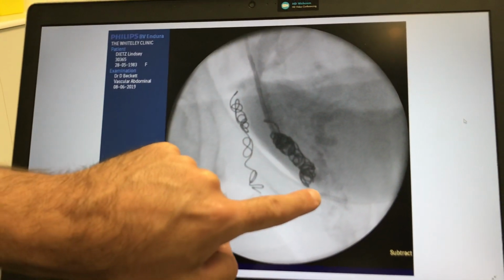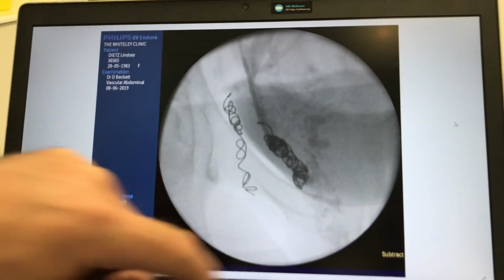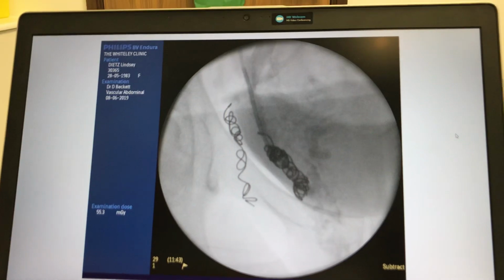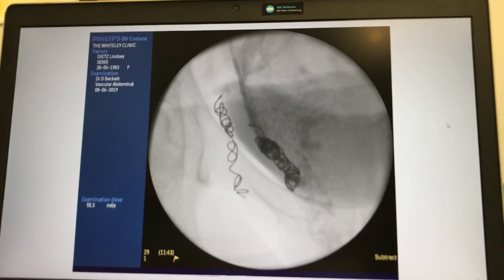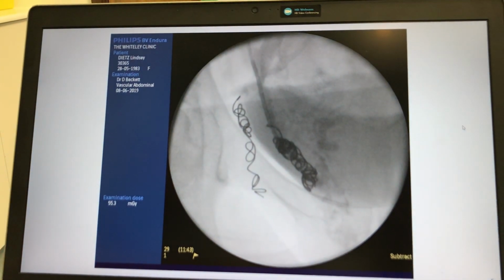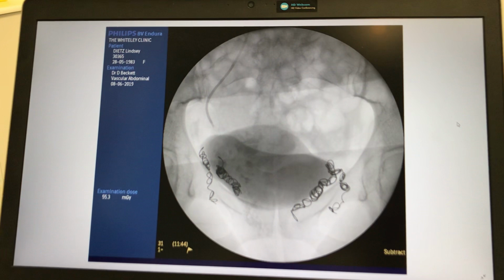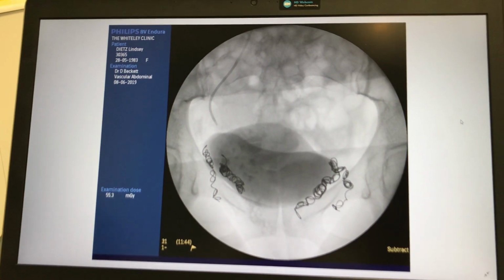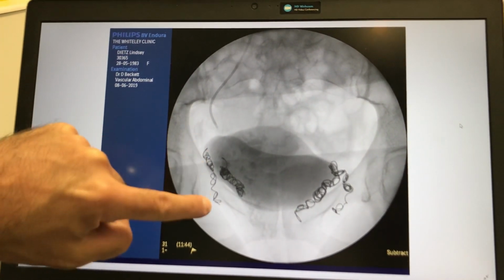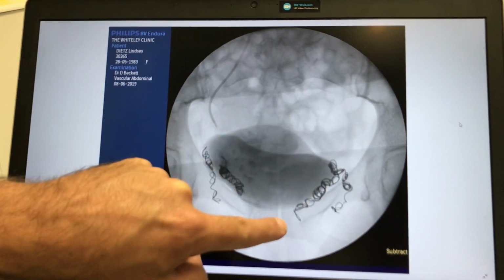And remember here, you can see these spidery veins that are coming down, and they're going to be going towards your vulval area as well. Okay. And that's what you didn't inject. So we did. Actually, I had the catheter here, and then I injected a little bit of the sclerotherapy agent into that. And that's kind of the picture at the end of your pelvis and what the coils will look like, okay? So that's your obturator vein, that's your pudendal vein.